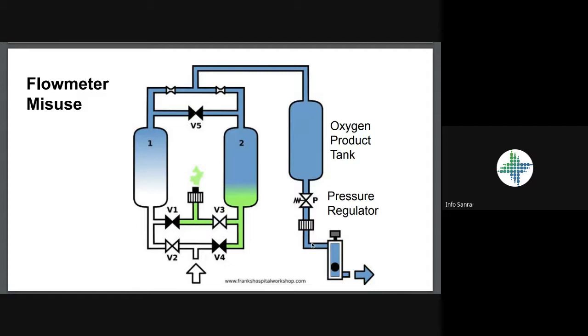So if we essentially cut the hose at the point between the bacterial filter and the flow meter, we can literally insert one of these needle valves in series. As we do this, we of course need to adjust the needle valve to the right setting. So how do we do this? The adjustment process is relatively straightforward. It starts by opening the needle valve fully on the valve itself to allow maximum flow through the valve.